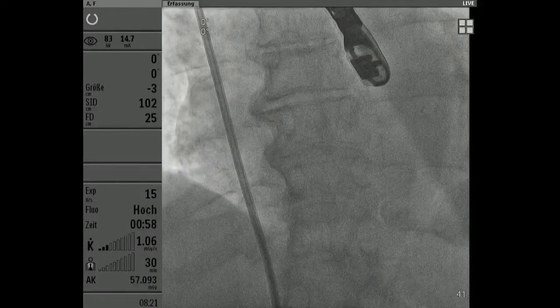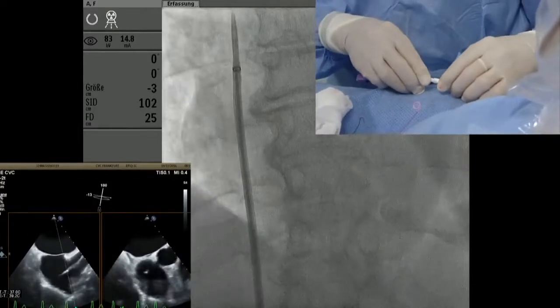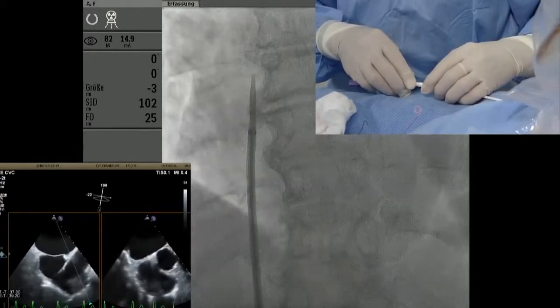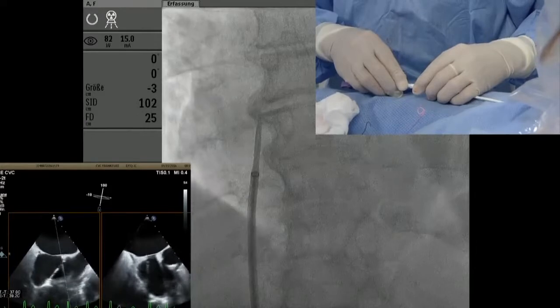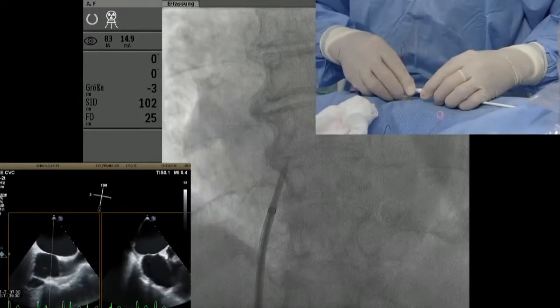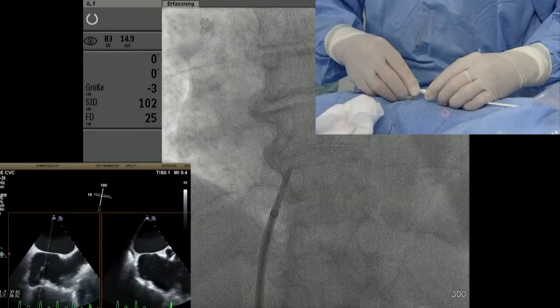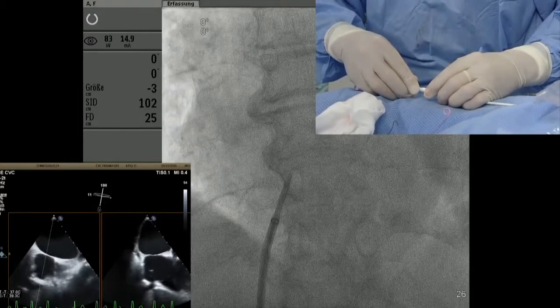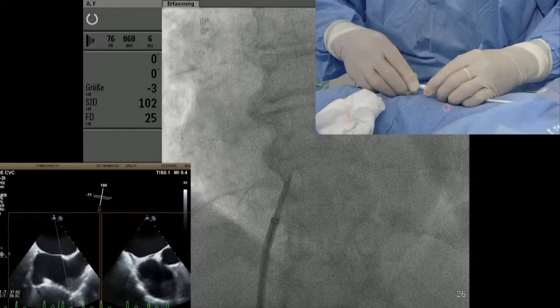You see on echo, you see the needle or the sheath in the SVC. Horst, have you ever broken the tip off a needle? Broken the tip of the needle? Yeah. No, I don't think so. Well, I'll tell you. Not so long ago, it was not a left atrial appendage, but I had a small child with a very tough septum. Like you, I bent the tip of the needle, still couldn't get across, tried several times. And I felt like a sort of break. The needle didn't embolize, but when I took it out of the dilator, just the act of taking the needle out of the back of the Luer lock, the tip of the needle broke off. Wow.